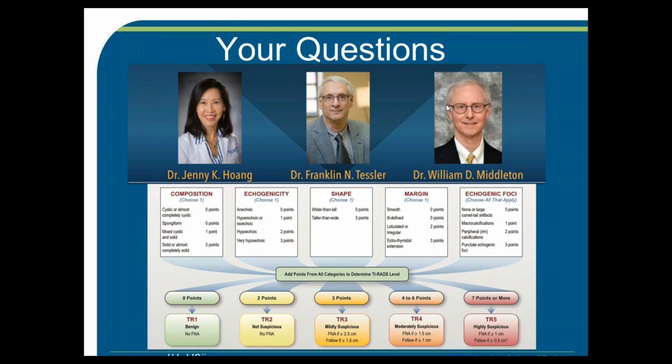Great. Bill, I have a question for you. It's about punctate echogenic foci. The question is from Claudia. What do you do with small echogenic foci that don't look like microcalcifications? And specifically, how do you distinguish them from tiny colloid calcifications? Do you ever struggle with that?